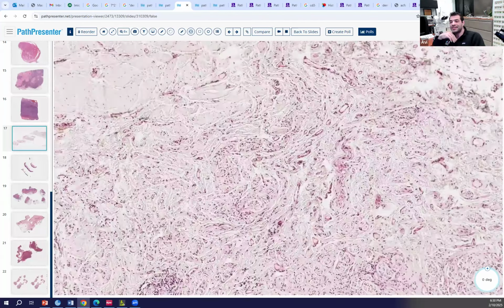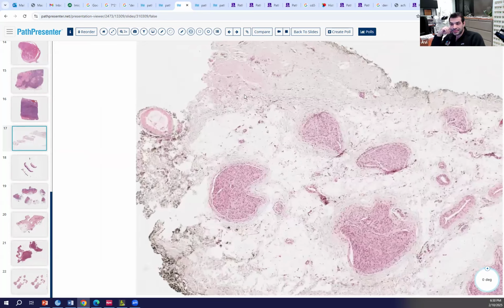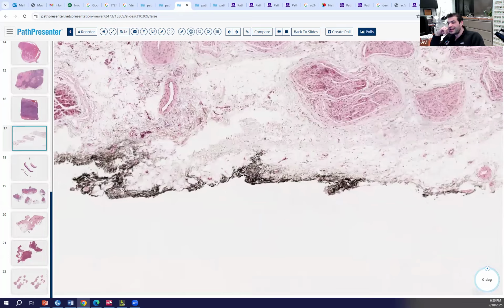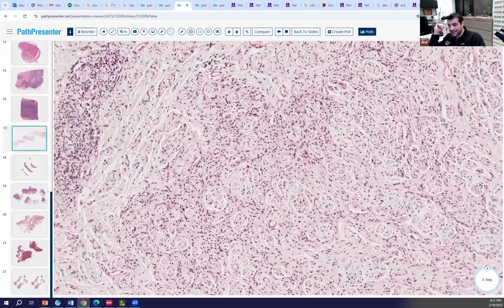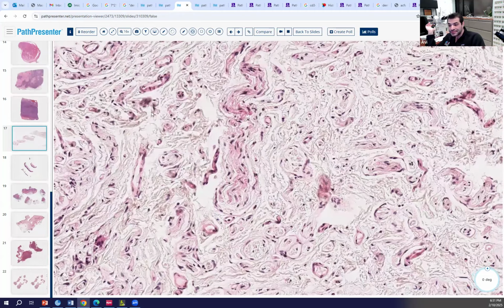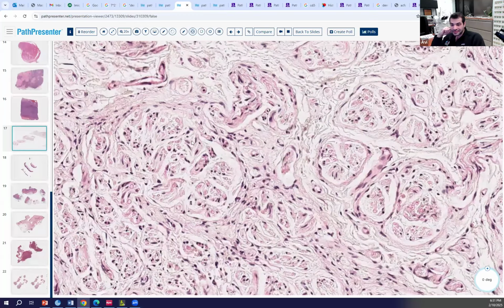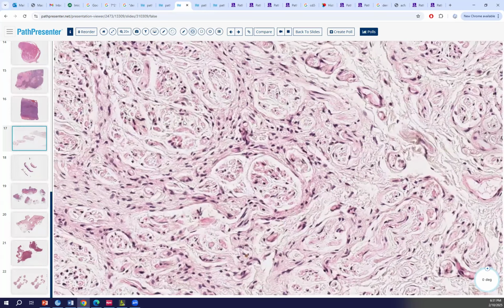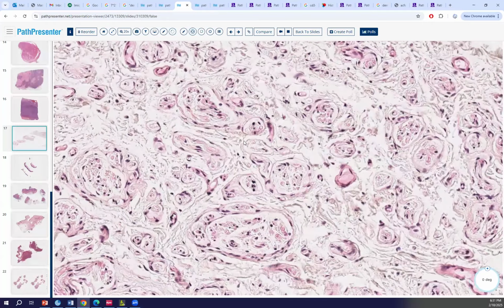Yeah, I was looking to see if it's acral or volar, to see if there are any signs of it being a Morton's neuroma, but to no avail. In any case, even if one is better than the other, you should still be able to differentiate the spindled look of nerve versus the spindled look of scar. Fibroblastic versus neural. They'll be discrete little nerve twigs within a background of fibrosis. That's all they basically are. They're regenerating nerve twigs, and typically they'll be in scarring fibrosis.